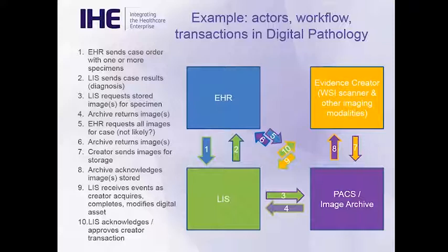And so we have an exciting road ahead of us to create an environment where we can have vended products that hopefully in the future are able to plug and play with each other to create digital pathology pipelines to enhance the workflow within the pathology laboratory, to redesign the way in which diagnostics occur in the world of anatomic pathology, but also to create a whole new level of interoperability and interaction among various vended solutions, so that we can really take advantage of having digital assets, such as being able to insert artificial intelligence, machine learning components, and various types of analytic tools into that pipeline to enhance the way in which a pathologist renders diagnosis for patients.